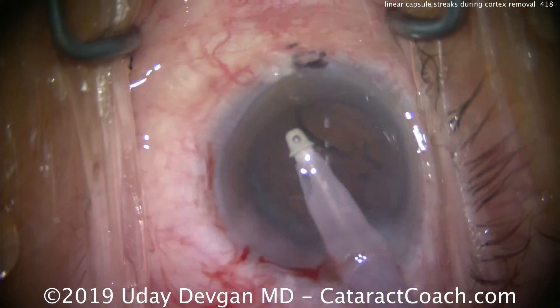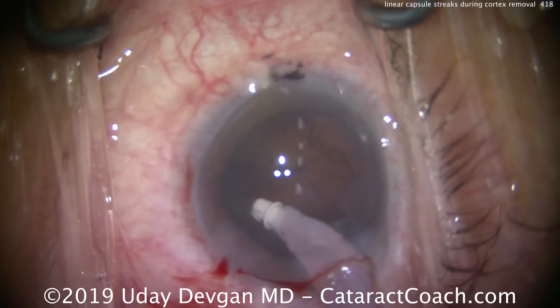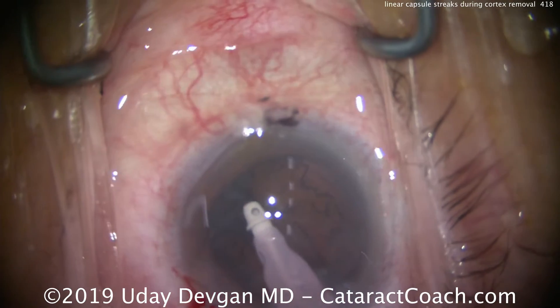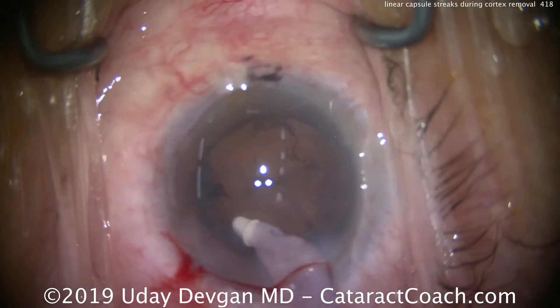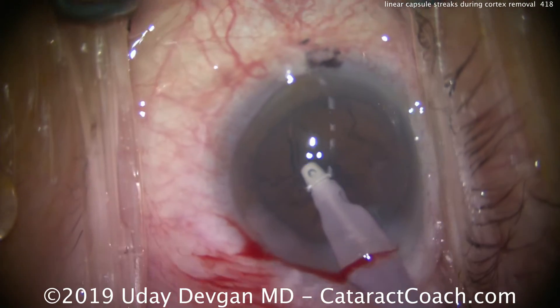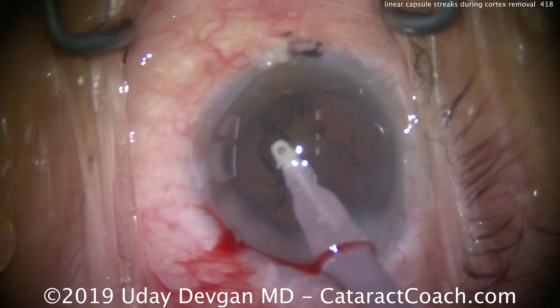We're on the lookout to make sure that the zonules hold up. We pull a little bit of cortex at a time, and that didn't want to come, so we put a little bit more here nice and gently, watching carefully, making sure the rhexis doesn't move, because that would indicate bad zonules. So far, so good. And as I start to pull on this cortex, something spooks me.